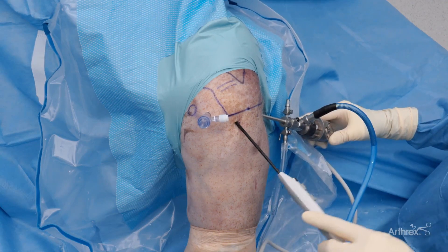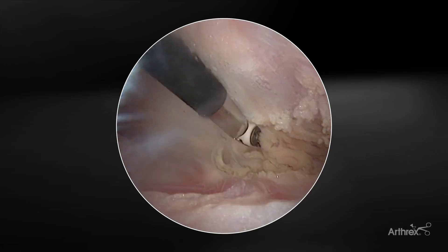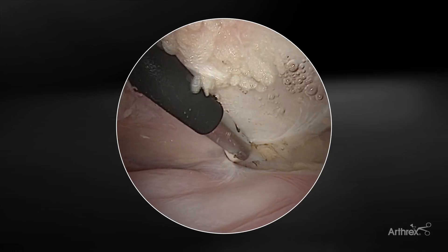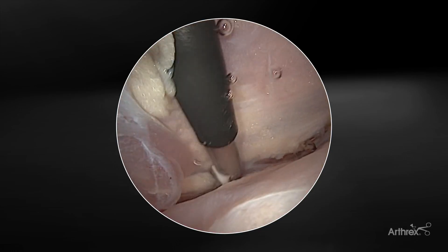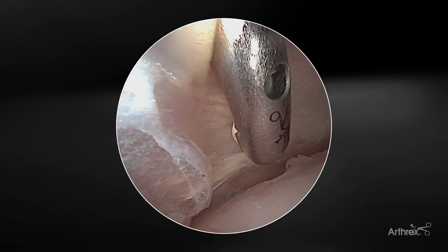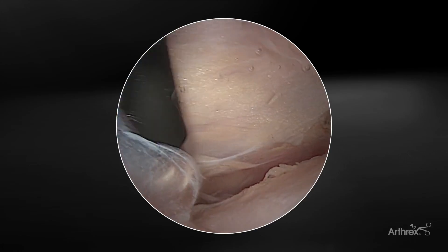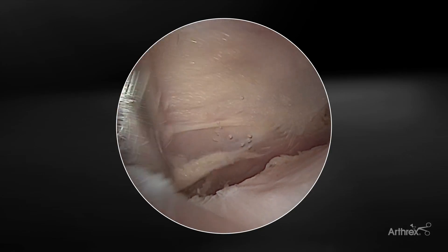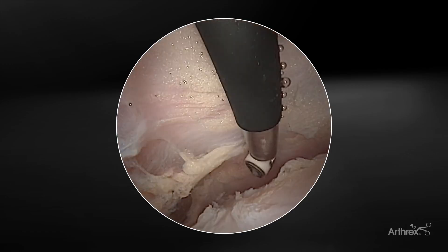Moving laterally, you can see some adhesions anteriorly. In individuals with large retracted rotator cuff tears who need a complete mobilization, you can see it does a really nice job of breaking through those tissue planes and freeing up that underlying rotator cuff. Some of that deltoid fascia is adherent anteriorly — we're going to open that up and release it, which will make it easier to perform a rotator cuff repair. As we prepare our lateral gutter for a double row repair, oftentimes that deltoid fascia will be adherent to the bone laterally. The geometry of the i90 allows for ease of insertion into the lateral gutter — rotate the device 90 degrees and release those adhesions down by the inferior part of the footprint, to allow space and real estate to put our lateral row anchors in for a cuff repair. Plenty of space now after we've released that fascia in the lateral gutter.